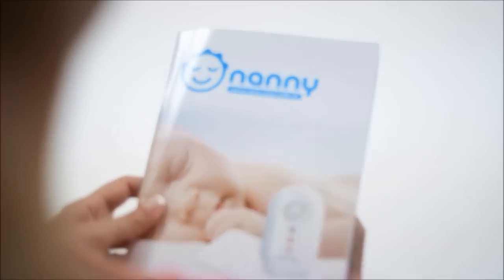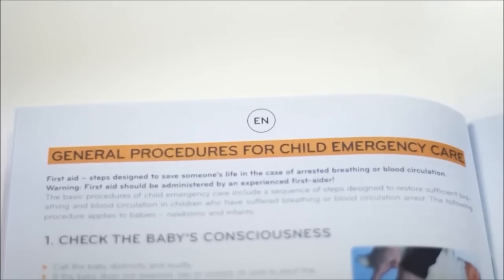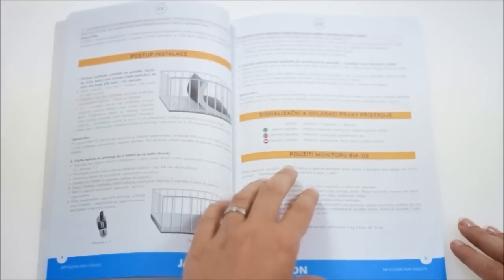I read the manual carefully just to be sure that I properly understood what Nanny was saying. In the manual there was a part about first aid which I really appreciated. It's always better to be ready for any possible danger. Installation itself was very easy and I managed it all by myself.